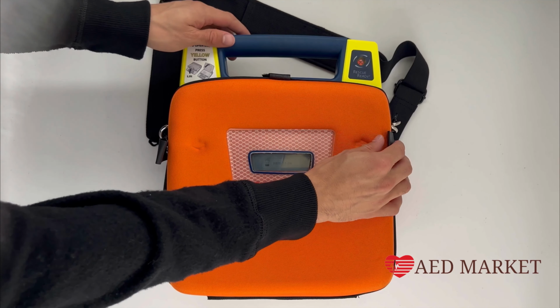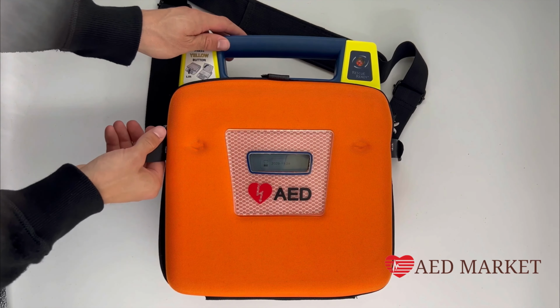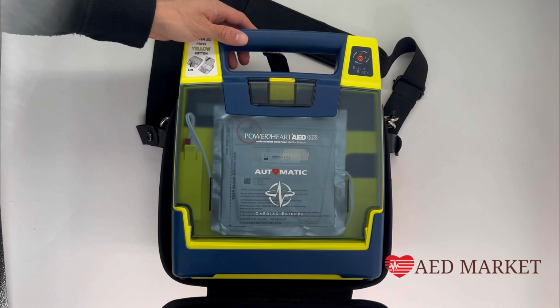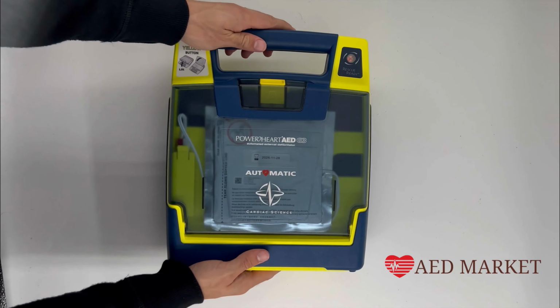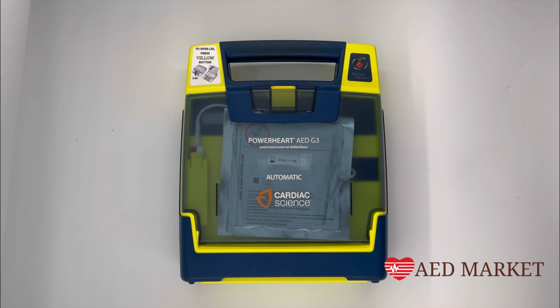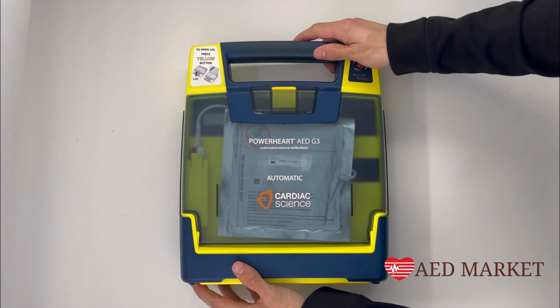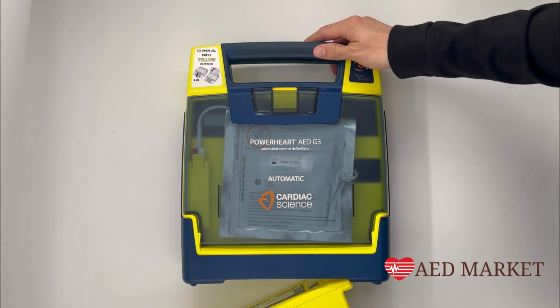To begin, easily remove the case by detaching the Velcro straps located on both the left and right sides of your case. Let's start with the battery replacement. The AED's battery is located at the bottom of the device. To replace it, simply pop it out.